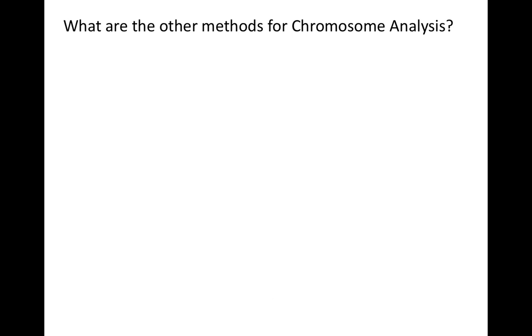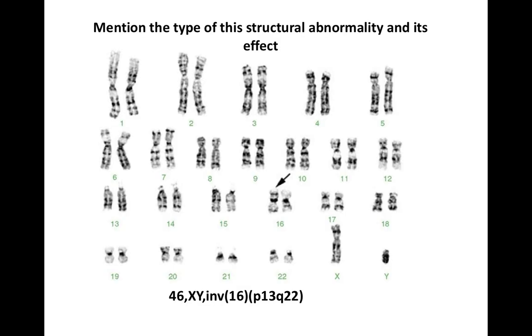So we come here to the end of the examples of the karyotype, and I would advise you to go through the presentation again after you finish, and to test yourself on writing the description of the karyotype by pausing during the presentation, and then you check on yourself.